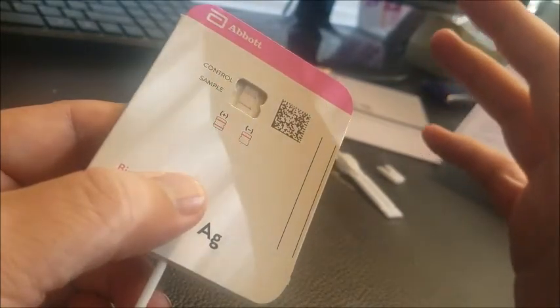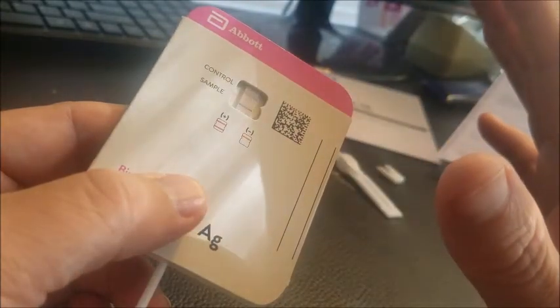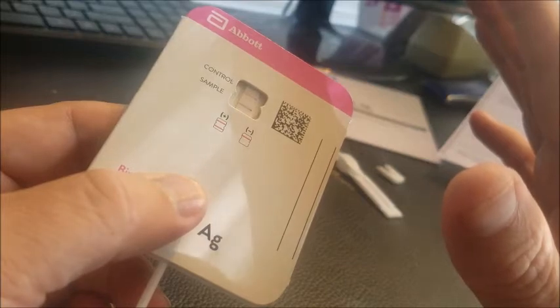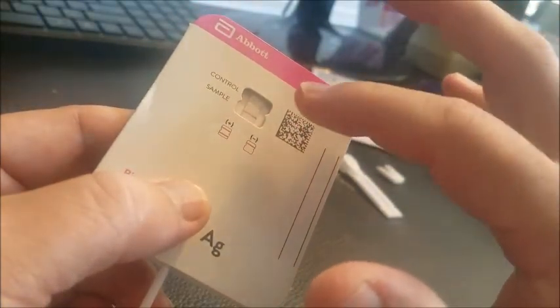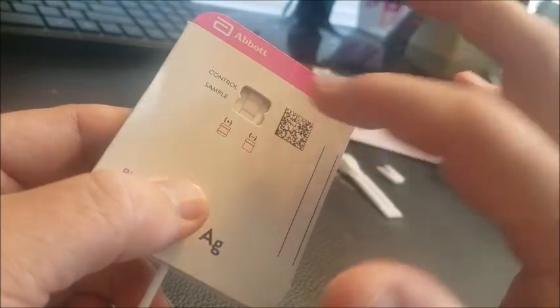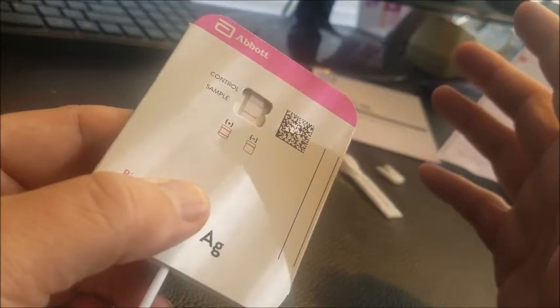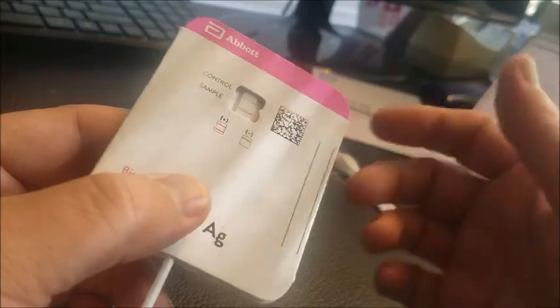Now, how will we know that the test is not accurate or void? If there are no lines whatsoever, that would mean it is void. If there are any blue lines at all — straight blue — that means it's void and you need to take it again or call the 800 number. Even if there's a blue and a pink, that still means it's void.